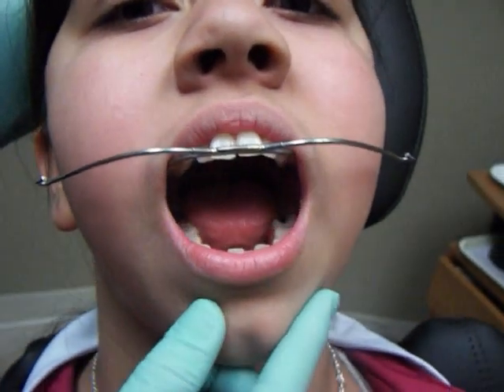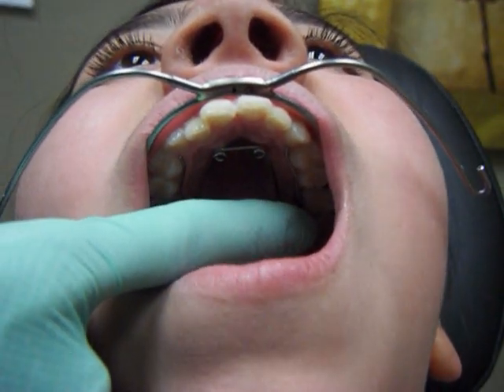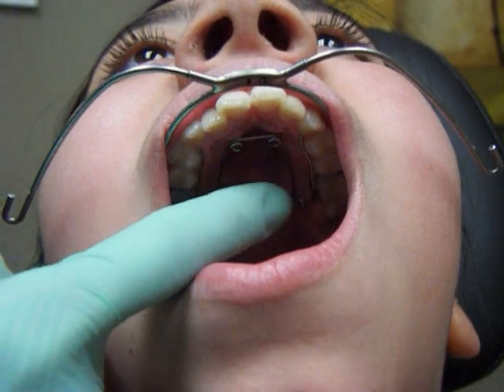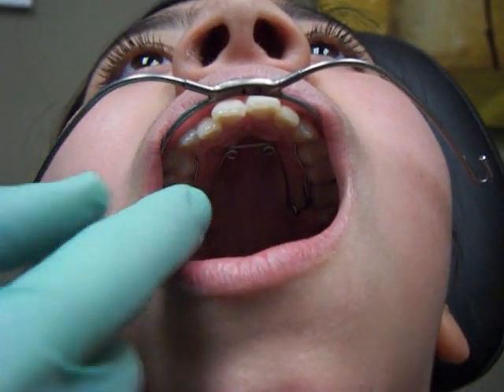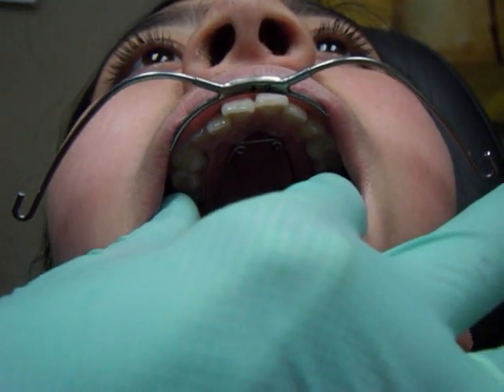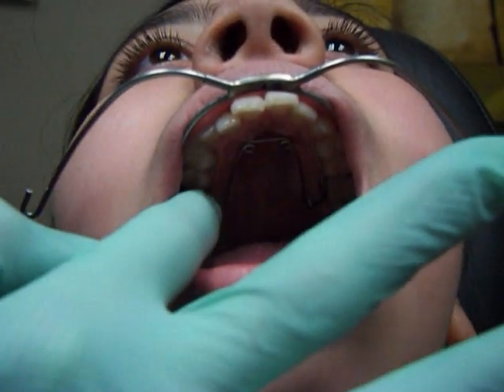If you just open really big for us, you can see that she has an appliance that goes across the palate. It is an expansion appliance which is widening her upper jaw, and it's also stabilizing the arch from left to right.